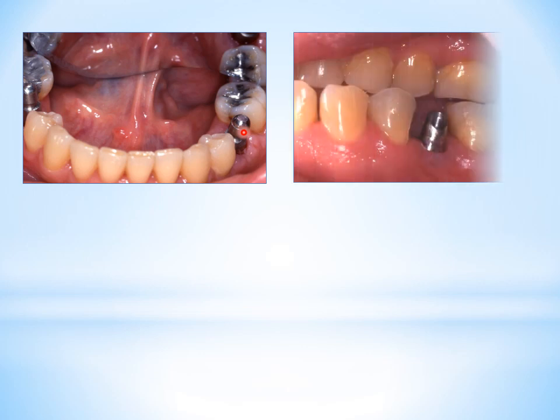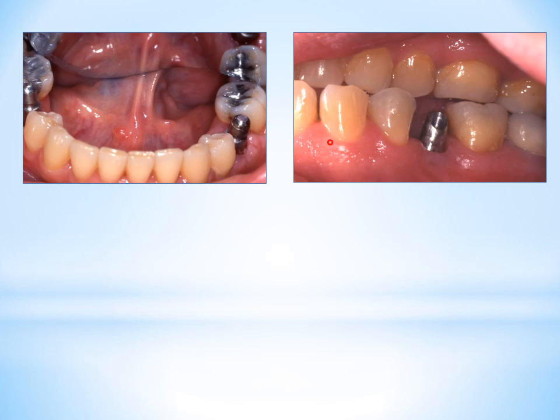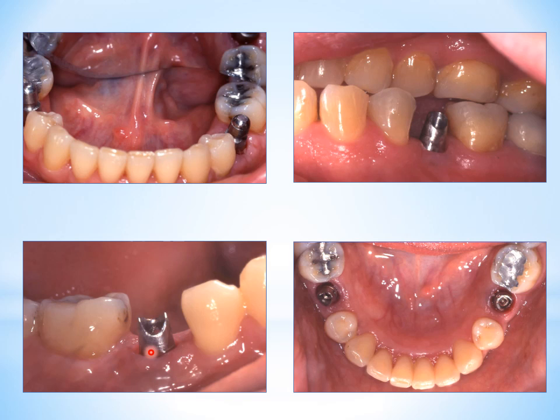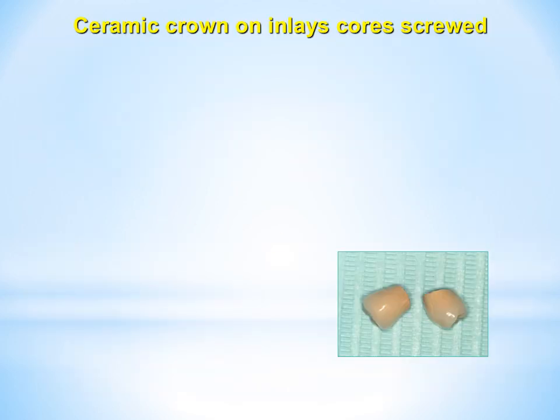Selection of the impression post and then taking the impression and preparation of the abutment, checking it in the patient's mouth to complete the construction of the crowns.